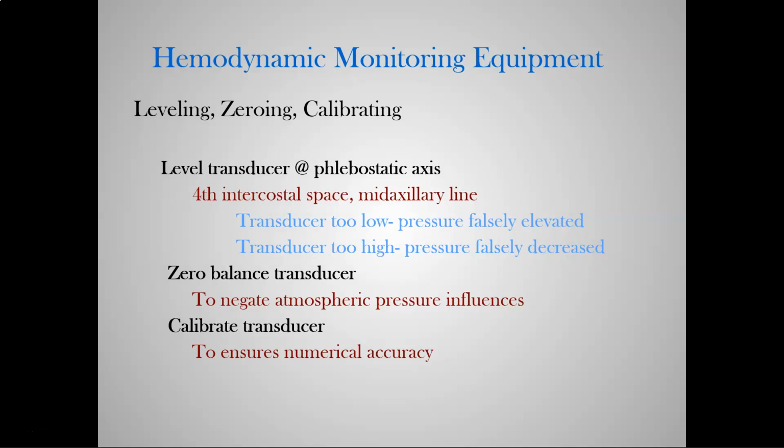And I can't tell you, and I mean like 80% of the time when I have some kind of acute change in pressure, we fall back to a change in the position of the arterial line, the transducer. There's typically a very clear reason, and I can troubleshoot that, fix it, and boom, pressures are back up to that 100 mark that we've been at all day. So just be aware of that.